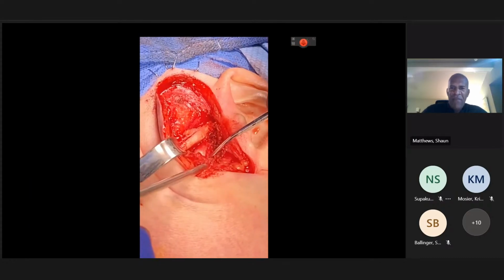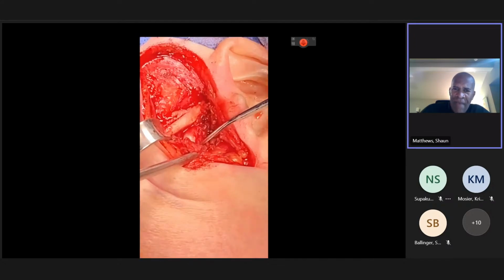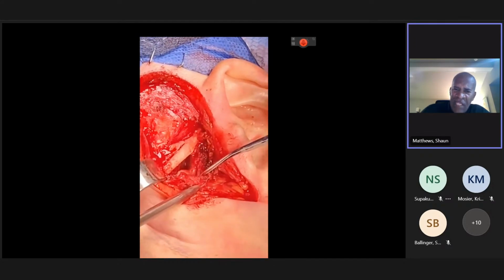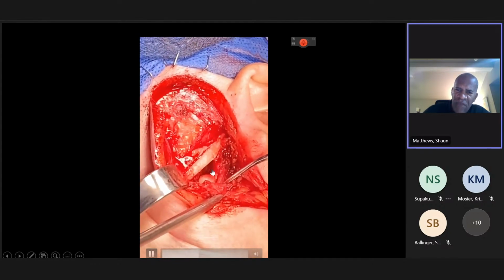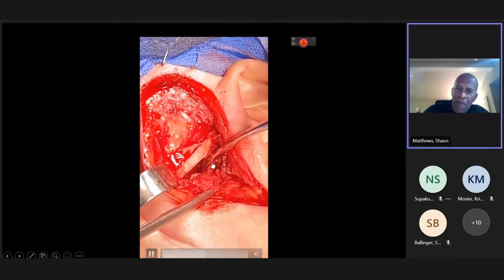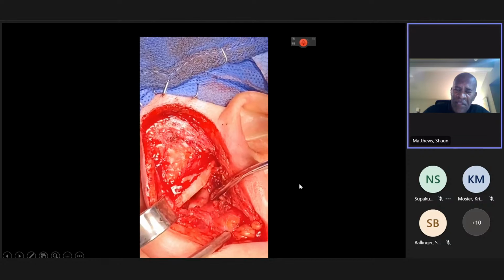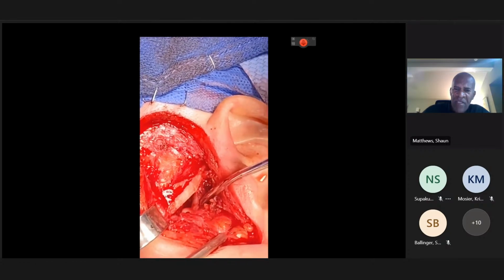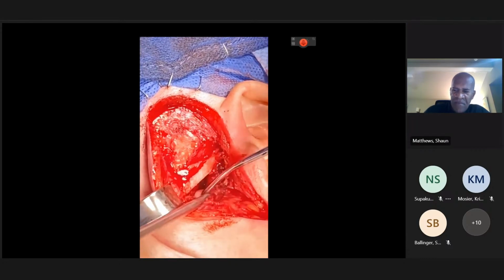So this is the end result of the eminectomy. You can see the condyle moving backward and forward. Now it's moving nicely. You can see the stretch of the retrodiscal tissues here. This is the articular disc. There's no barrier now, no eminence for that to be stuck in front of, and there's no way that this condyle can dislocate. That's the successful TMJ eminectomy.